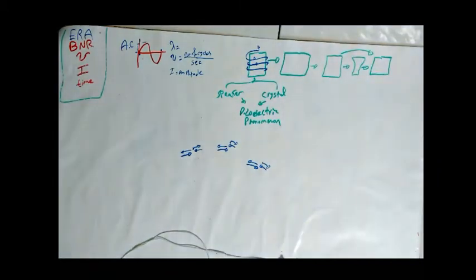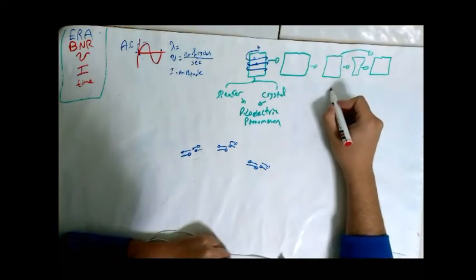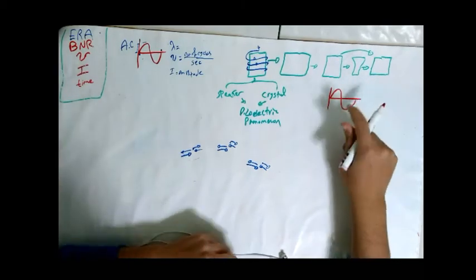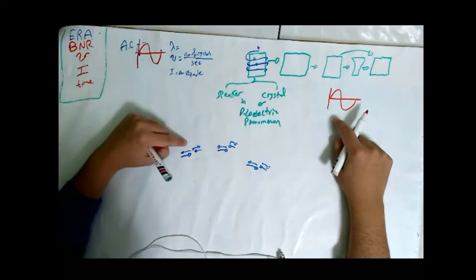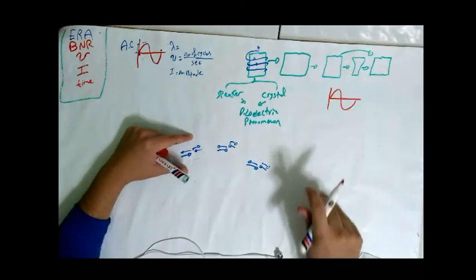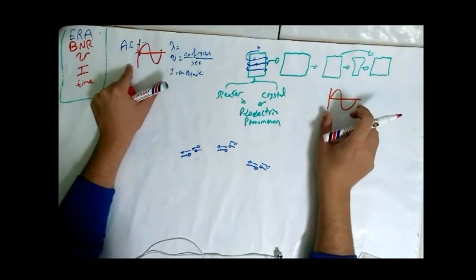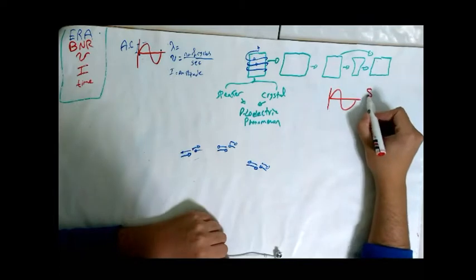If I want to draw a graph for the changing or vibration of the material, it's going to be like this, which is similar to the alternating current, because the alternating current is the source of producing the changes. So any changes in the alternating current will cause changes too in the vibration and the graph of the crystal or speaker. We call this shape a sound wave.